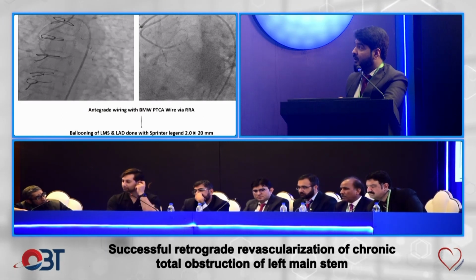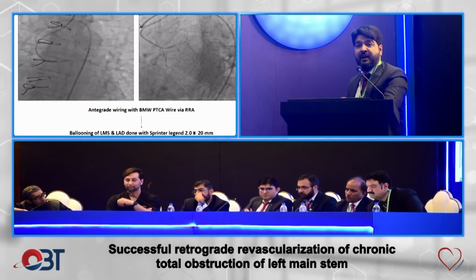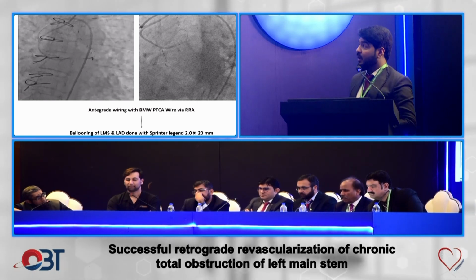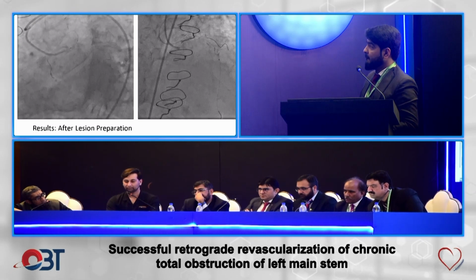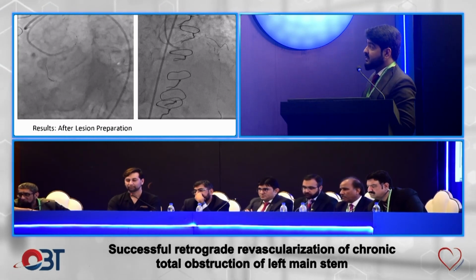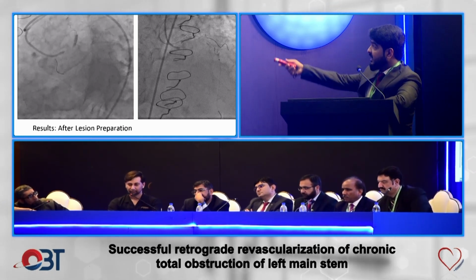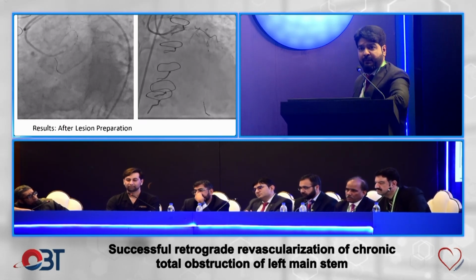After that, we did antegrade wiring with the BMW, and we prepared the lesion by using semi-compliant balloons. Once the lesions were prepared, these are the slides showing that we are preparing our lesions with semi-compliant balloons. And here's the final result after lesion preparation with the semi-compliant balloons.